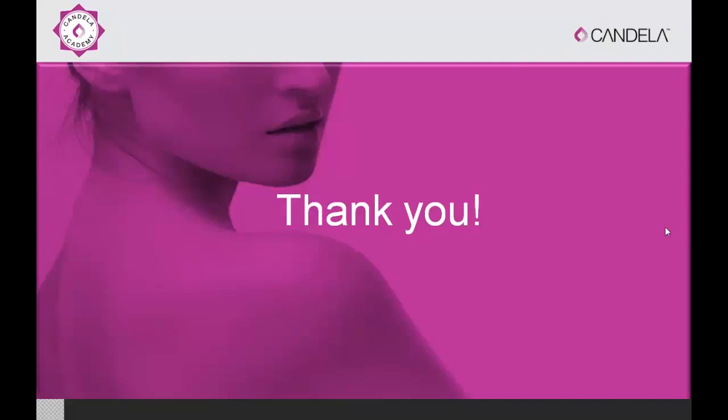That depends, obviously, on the ink, but you can do a spot test and look for that. And even if it does oxidize and turn darker, that doesn't mean it cannot be amenable to further treatment. You can try to treat again, and some do respond to the 1064 when they darken. And the other way is to combine with the fractional CO2, as I mentioned.